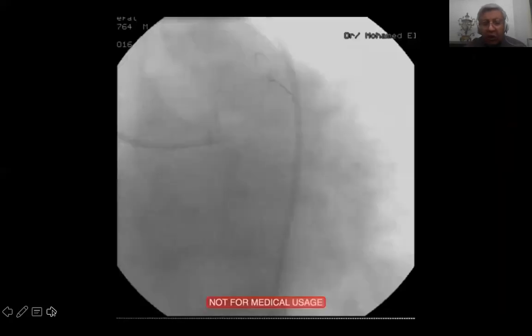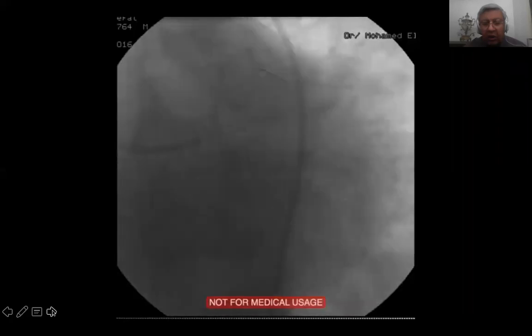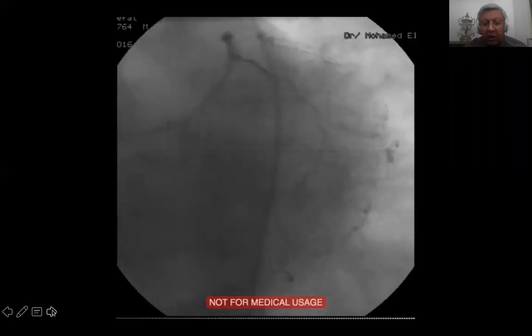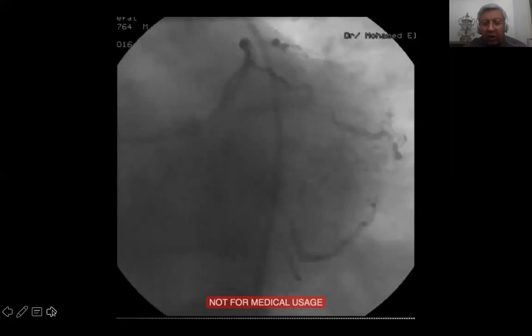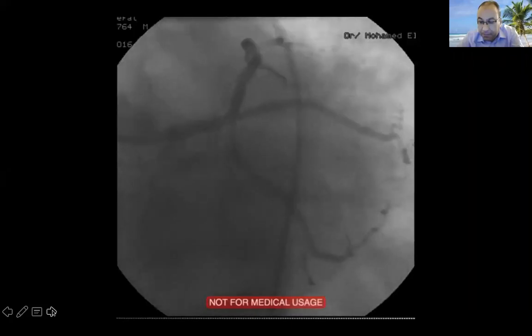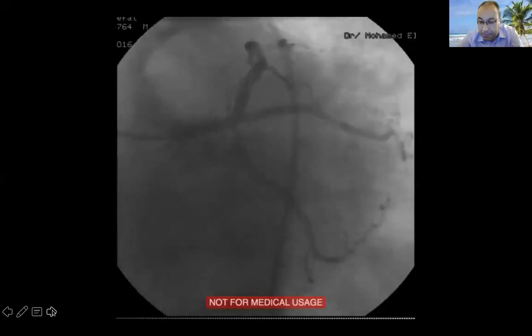Thank you, Dr. Stehi. It is a beautiful case, of course, but you said that at that time, in 2016, you didn't have IVUS in your cath lab. Yes. I think if this case were repeated now, the strategy may be changed. Especially, I was very happy with these results. Even today, if I use IVUS, I will also prefer to finish like this.